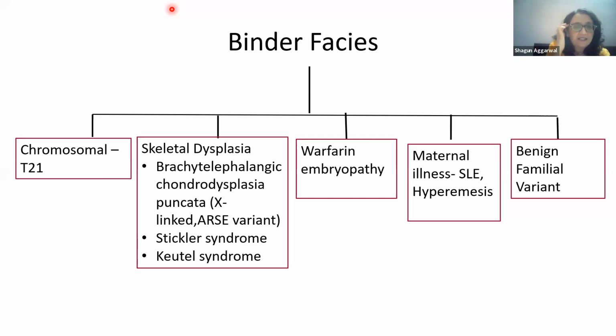So it presents in male fetuses, and in fact, this is what we had suspected in the third case in that particular fetus, but on exome sequencing, there was no mutation in that case. This is one of the commonest skeletal dysplasias which presents with this kind of facial appearance, and the epiphyseal stippling can often be seen antenatally, but sometimes it may be a little tricky to pick up. Often the bone shortening would come much later in pregnancy, so you would not really see it in the second trimester scan. So again, the importance here is of suspecting it and doing the correct test, which is exome sequencing, to pick up this particular condition.